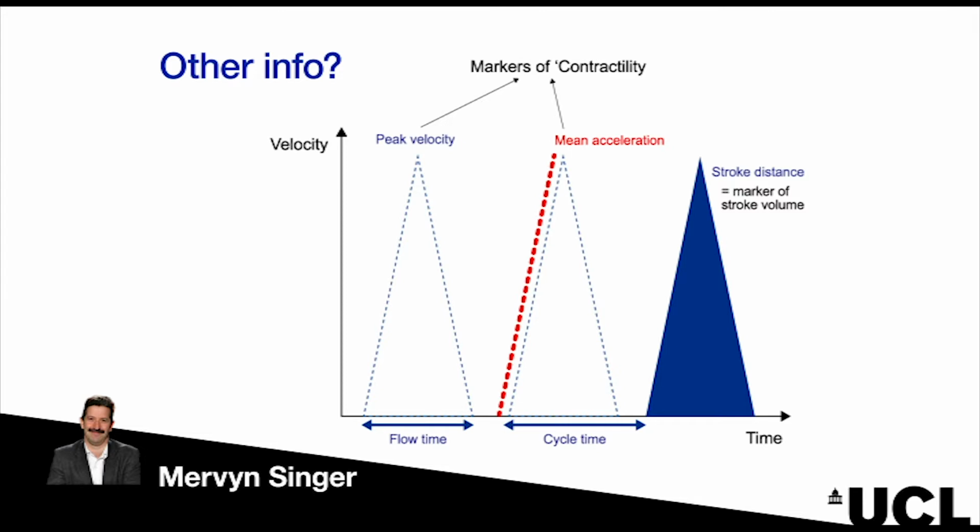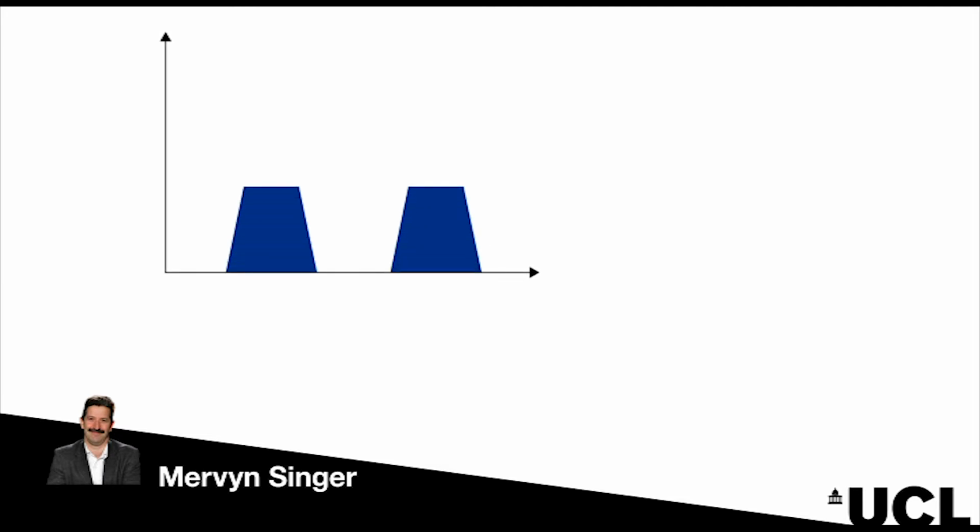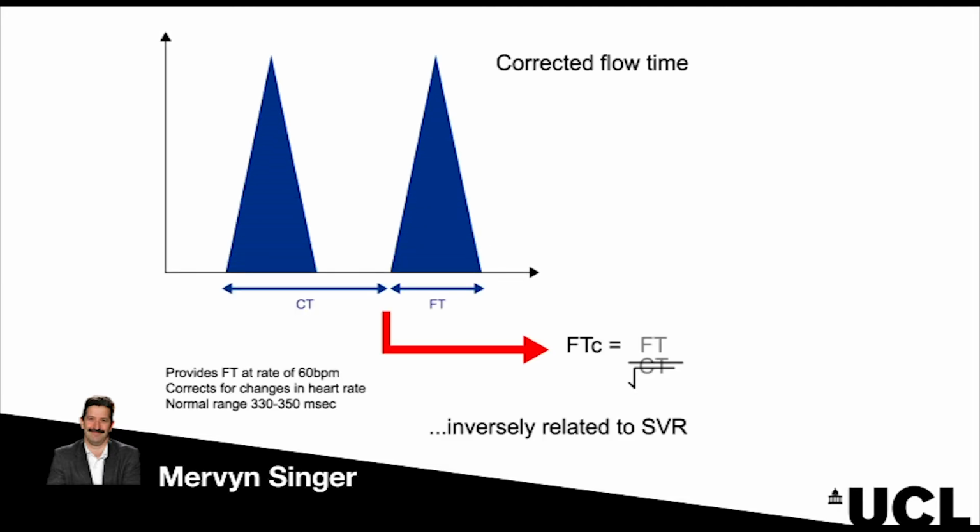The flow time is the base of the waveform, and the cycle time is the time from the beginning of one waveform to the beginning of the next. So that equates to the RR interval on an ECG. So you can get from the waveform shape lots of information. Clearly, the filling of the heart is affected by the heart rate. So if there's a very fast heart rate, the heart doesn't necessarily have time to adequately fill.